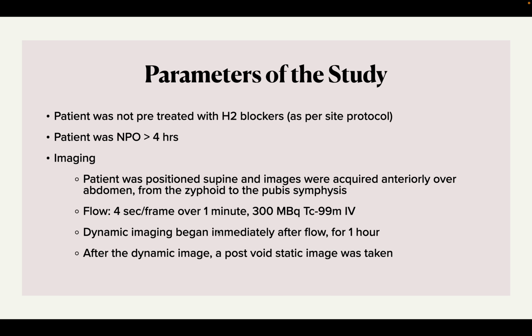Some parameters of the study. As per site protocol, the patient was not treated with H2 blockers. Patient was NPO for over 4 hours. And then for the imaging portion, we positioned the patient supine. Images were acquired anteriorly over the abdomen. We used the xiphoid and the pubic symphysis as anatomical landmarks to basically get the best view.